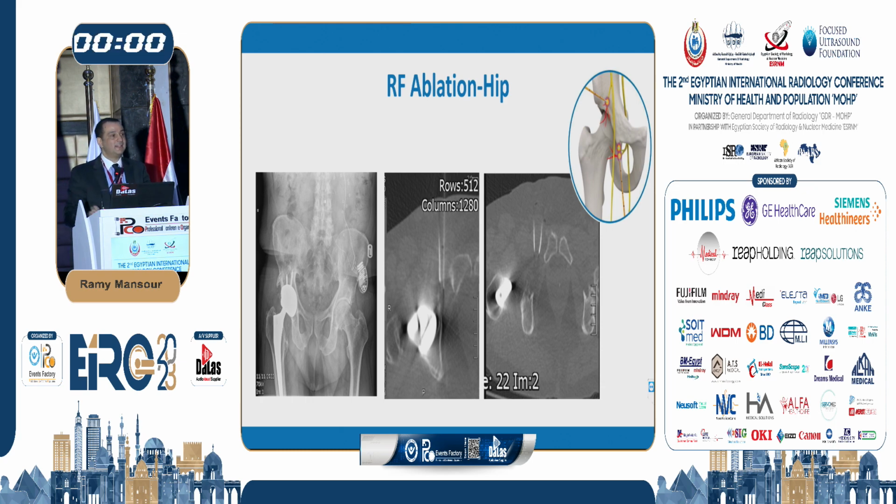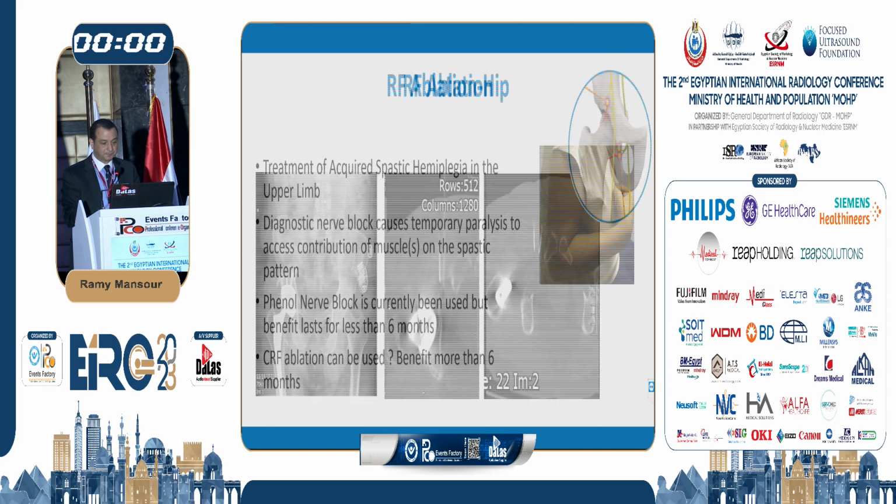The reason we did bipolar in this patient is that, as you can see, this patient has a spinal stimulator. One of the contraindications of unipolar is when patients have a cochlear implant or pacemaker or spinal stimulator, because there are some reports that radiofrequency ablation can cause malfunction. So if you want to avoid that, you need to do the bipolar technique.